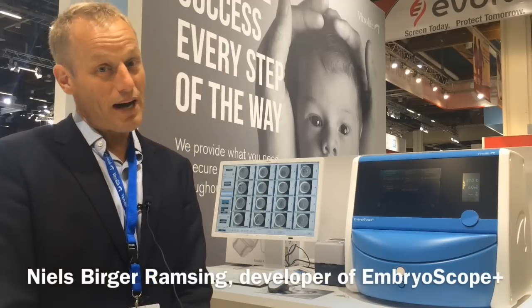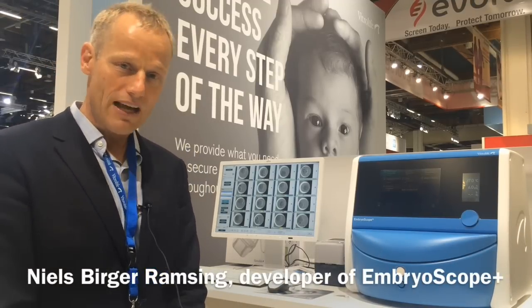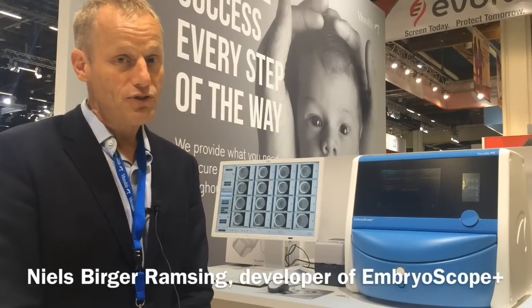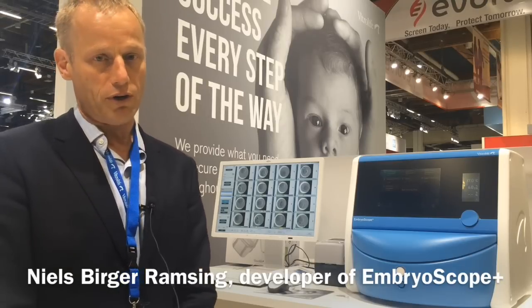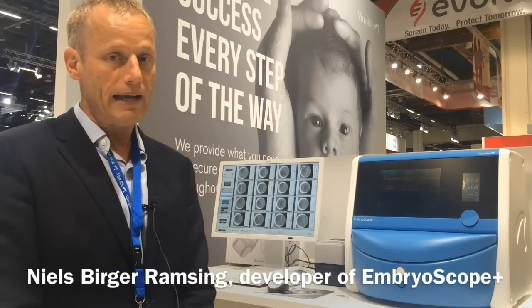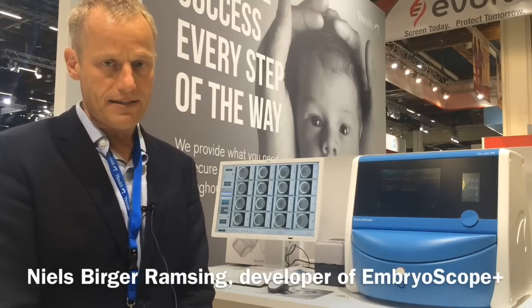We are proud to announce the latest time-lapse instrument from Vitrolife: the EmbryoScope+. It's comparable to the original EmbryoScope except it has a very high capacity and it's designed for improved workflow. It uses barcodes and a lot of features to make the whole handling in the clinic simpler.